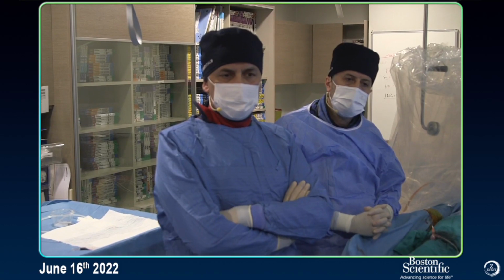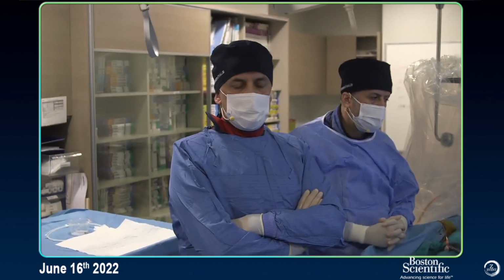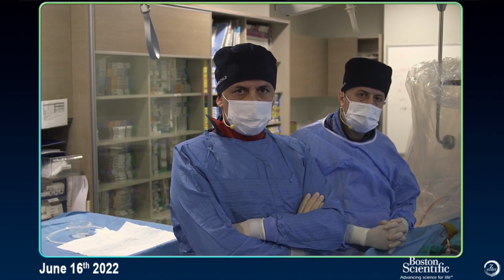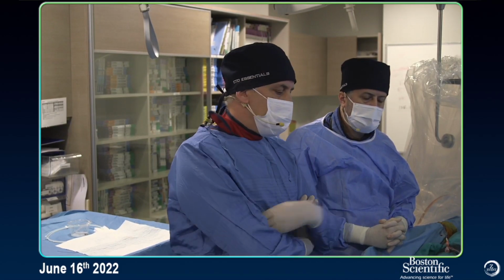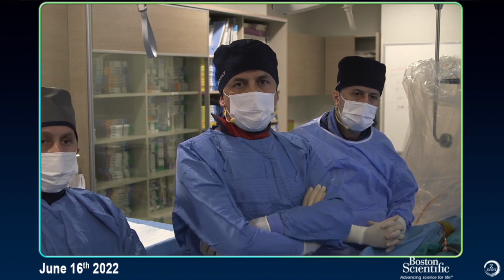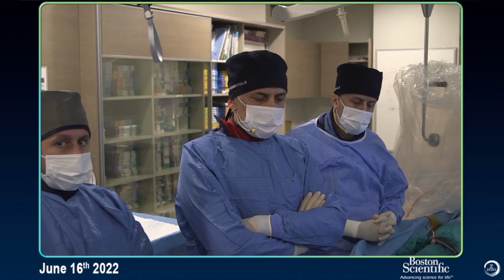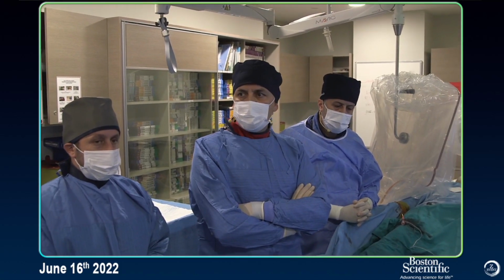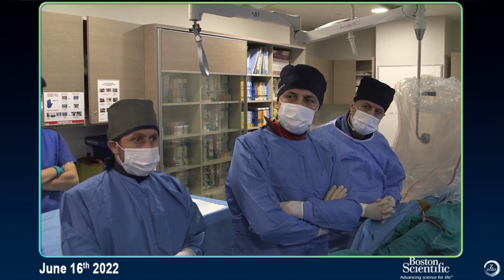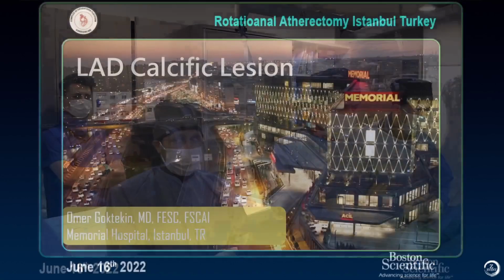First of all, I'd like to thank Boston Scientific for giving us this opportunity. Today, we would like to do a rotablation case with you, and I'd like to introduce my team. I have Ahmet Shakir on my left and Hashim Tuner on my right, and I have Gizem as a nurse and Samet as a technician. Before we start, I'd like to ask Mohammed Hashim, a fresh fellow from Pakistan, to present the case for you.